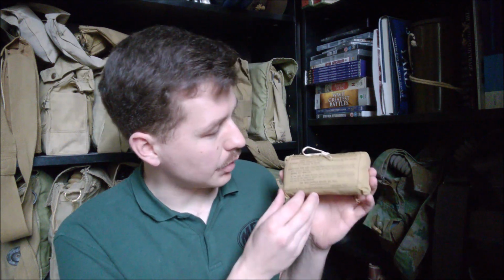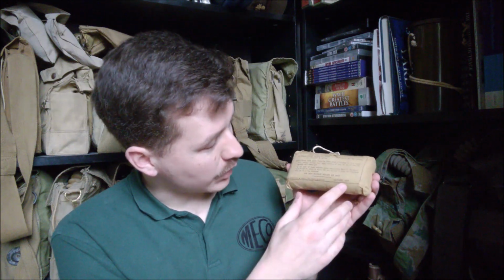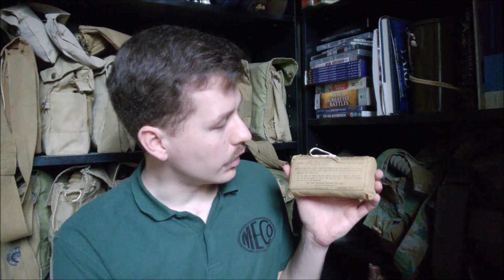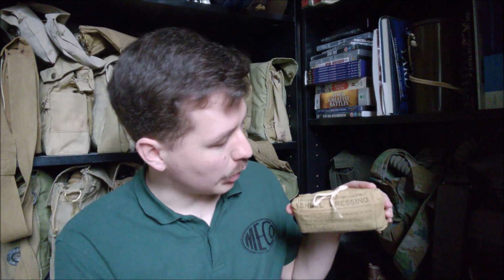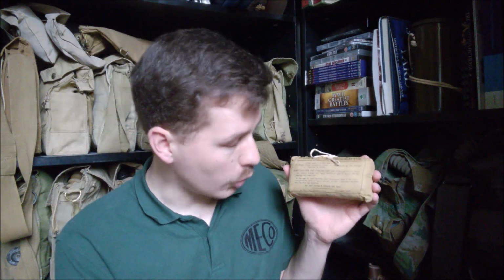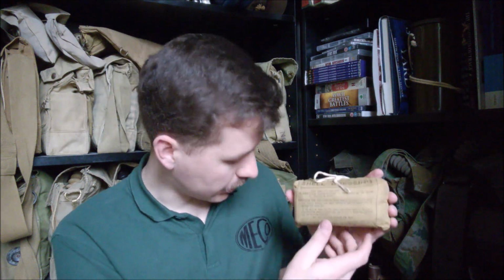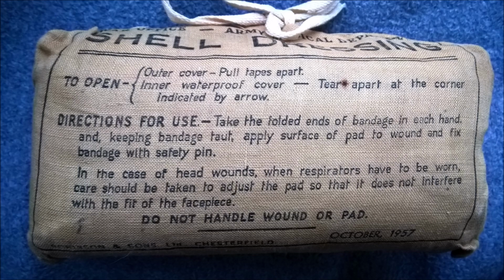They came with a shell dressing bag, and they are all 1950s dated. And the design stayed essentially the same. So you have this outer khaki packaging, very similar to that which was first introduced in 1916, with a tie at the top, and then this seam here is stitched and easy to pull apart, so that you can get at the inner. Inside this there's a waterproof. I don't have any open, unfortunately, to show, but inside this is a waterproof packaging, and then inside that is the dressing. Here you can see the outer packaging of the shell dressing, the date stamp and so forth. If you wish to, you can pause the video here to read the instructions.